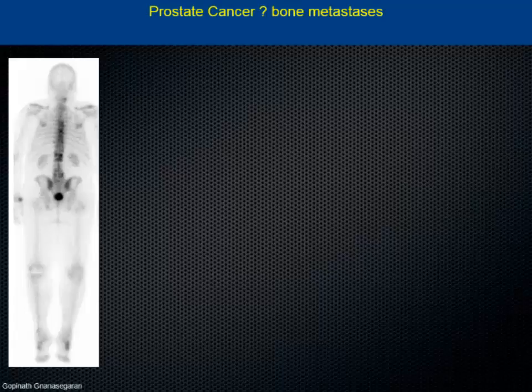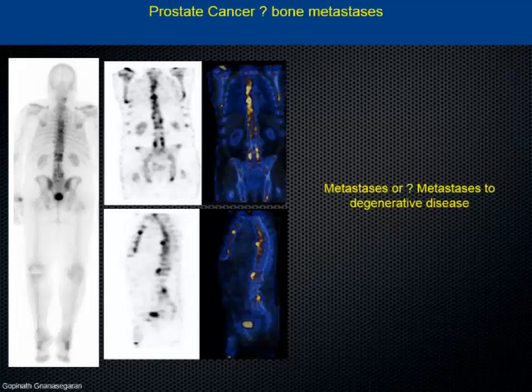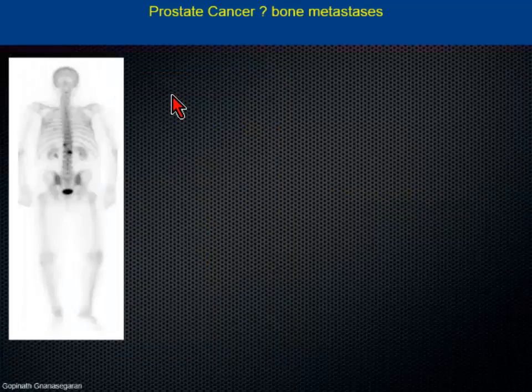Okay. If it had said that, I would have agreed, because I wouldn't have asked for it. If it was some other day, I would have said, okay, all these are suspicious. You would have said probably metastasis, but fortunately, all this turned out to be just osteophytic changes and facet joint disease, and it was all degenerative. What was thought to be metastasis changes over completely to degenerative disease. So that was a significant diagnosis. Nobody can diagnose based on your whole body bone scan.